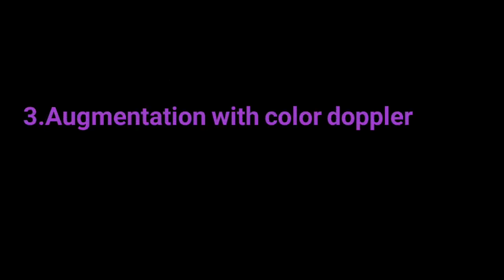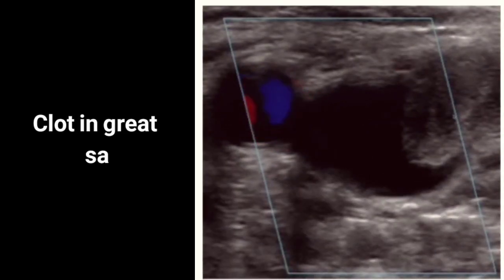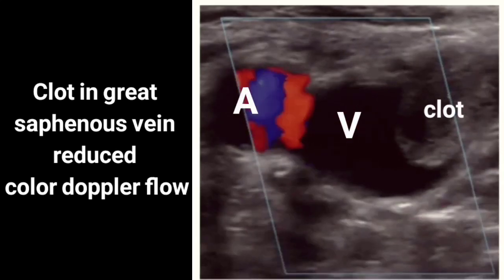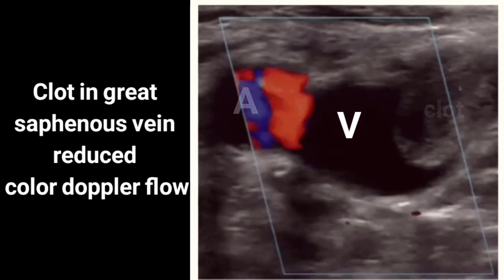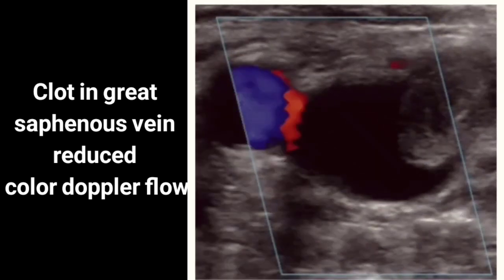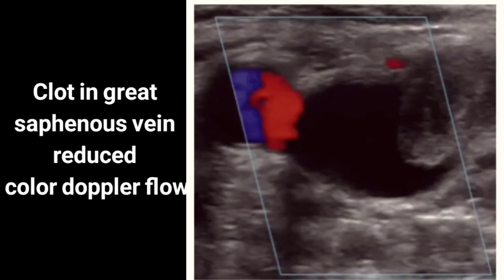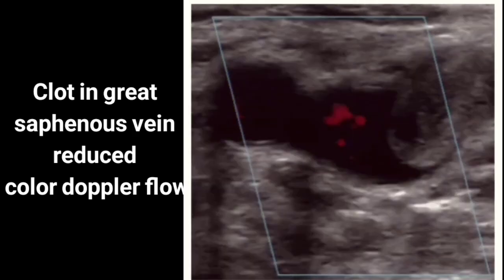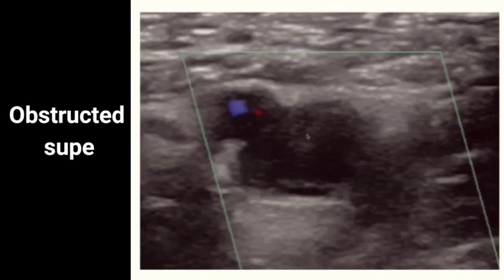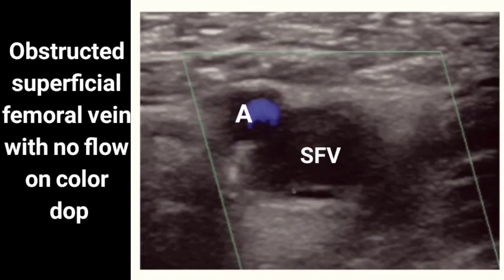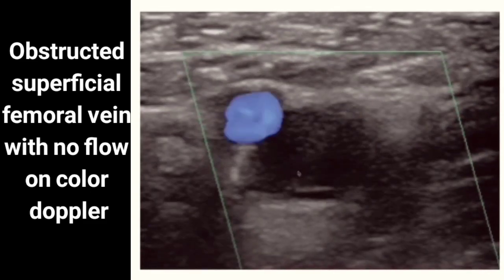Number three: augmentation with color Doppler. We can augment venous flow by squeezing the leg distal to where we are scanning. If color Doppler demonstrates a homogenous increase in venous flow, this suggests there is no occlusive thrombus between where we are squeezing and scanning. If there is no increase in venous flow, there could be a DVT. Use this method with caution, as there could be a risk of dislodging an existing clot and causing pulmonary embolism.